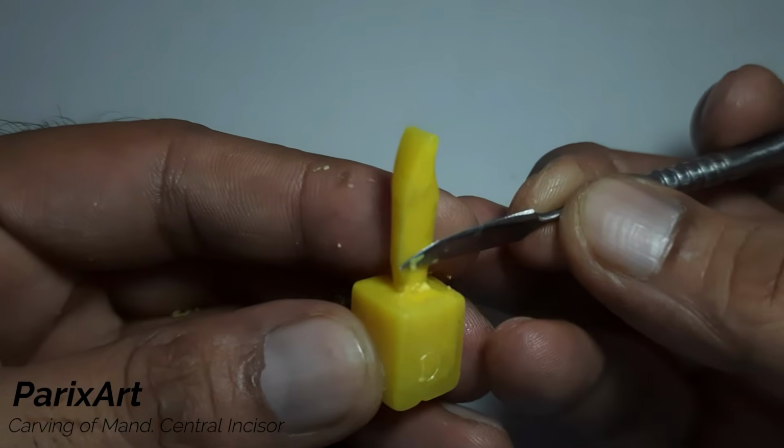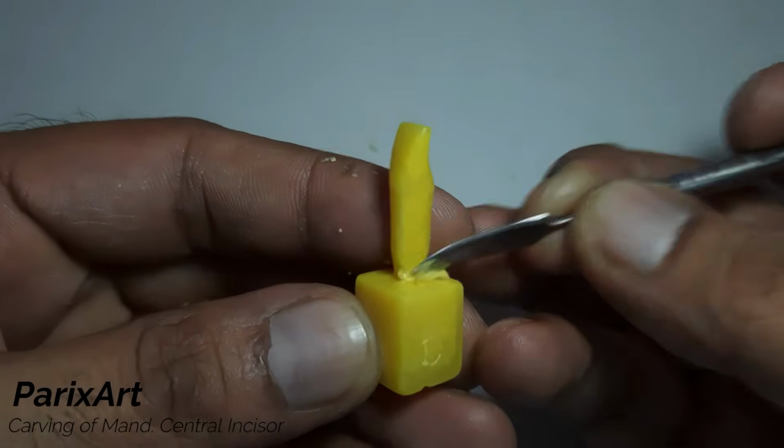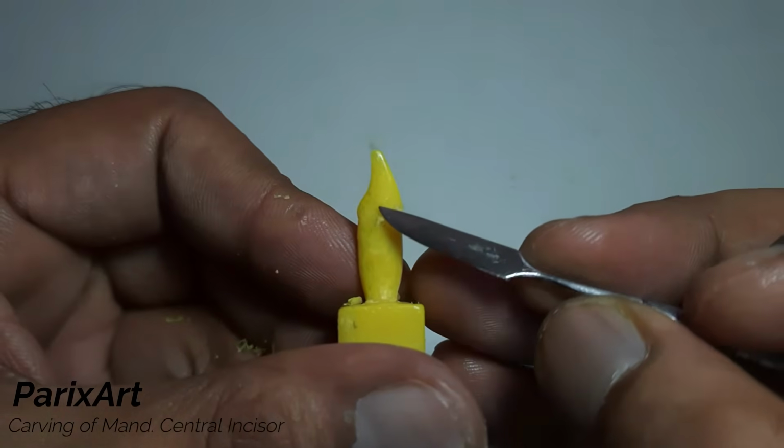Give slight taper at the apex to the distal. Do the same on the opposite side.